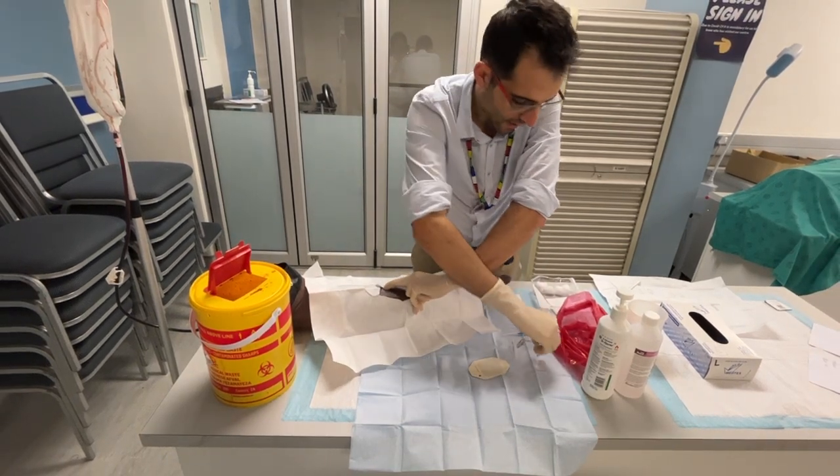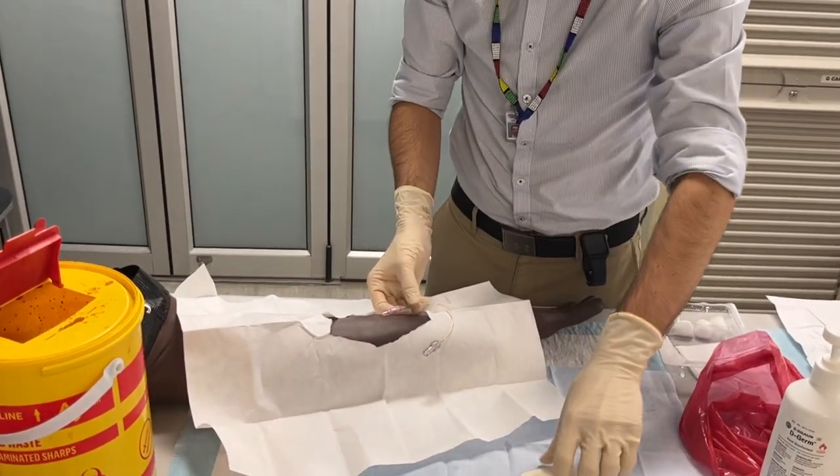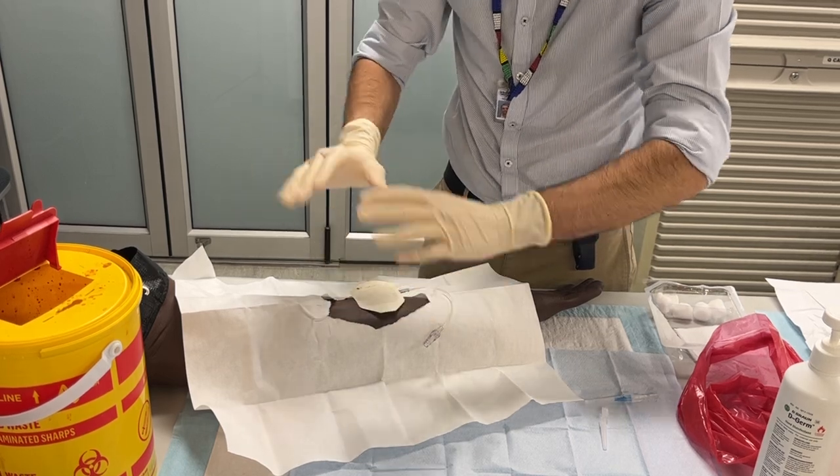What I'm going to do is insert the short line. I'm not going to go through the rest of the procedure, but you're then going to put your dressing over and clean the area, etc.